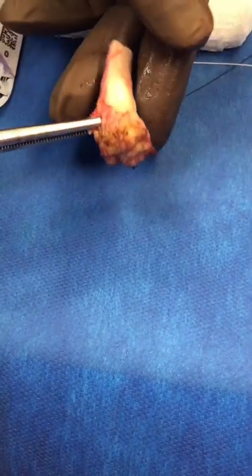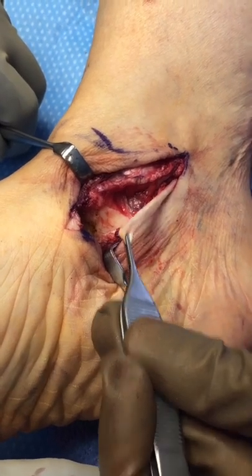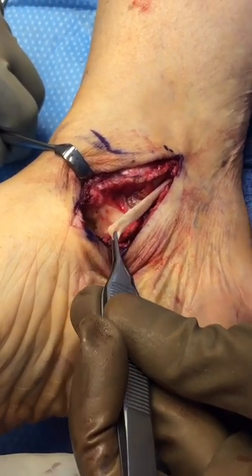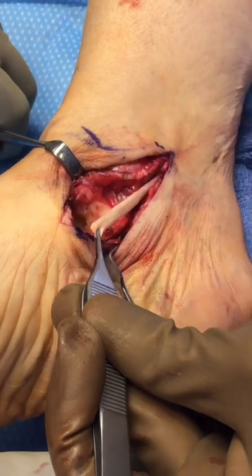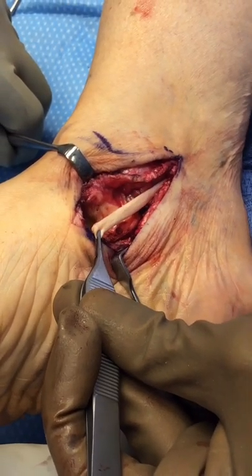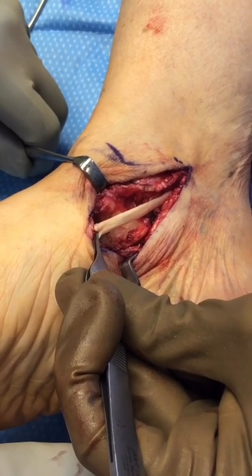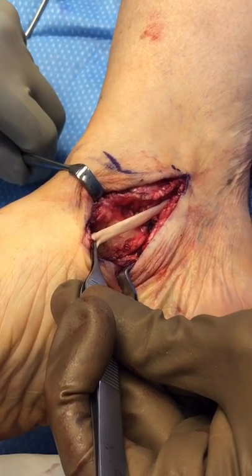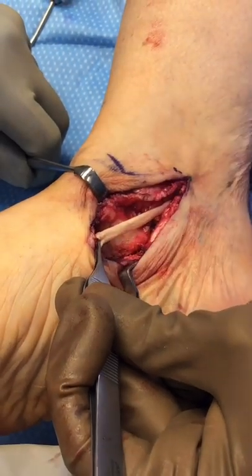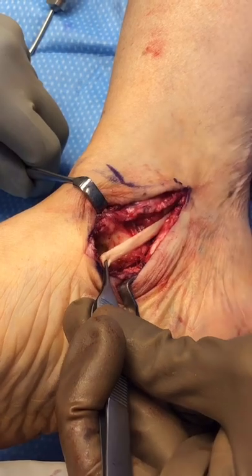This is the flexor digitorum longus tendon that we will be transferring to the navicular to substitute for the diseased posterior tibial tendon. We will put an anchor in the bone and re-hook this up here, and that will then serve the function of the posterior tibial tendon. Then we will close this tissue and the skin, and we'll be all done.